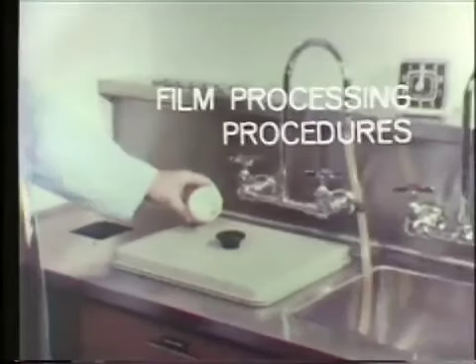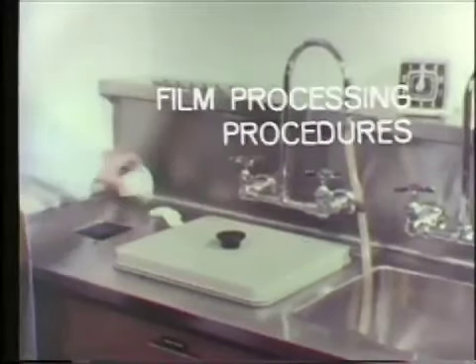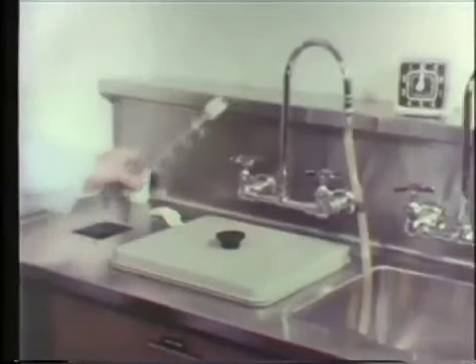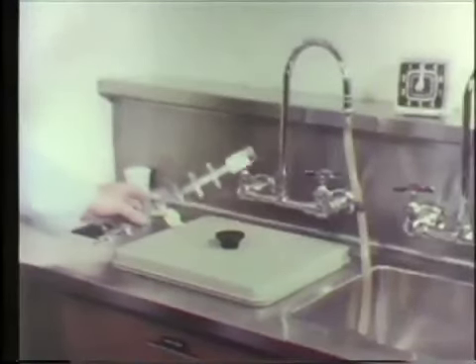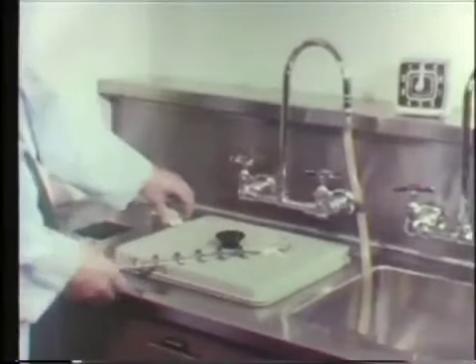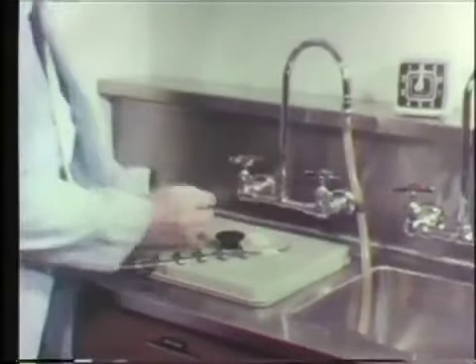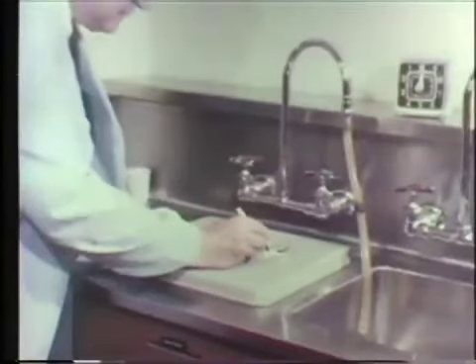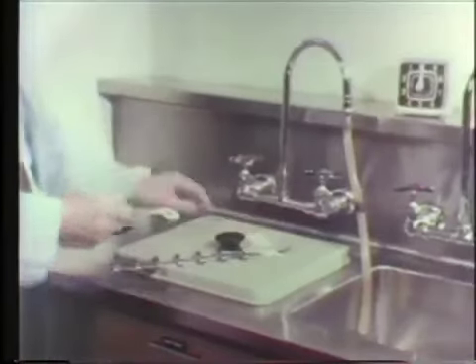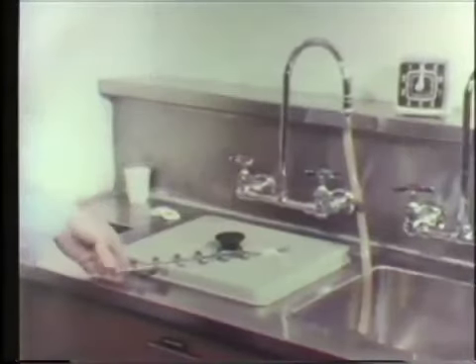We're about to process films. The exposed films were placed in the paper cup. Now they've been put down on the counter. We secure a developing rack that will hold the films while we carry them through the processing bath. An identification slip bearing the patient's name is put into view, and we copy the identification onto the little white plastic tab at the top of the developing rack. Then the little card with the patient's name can be discarded.